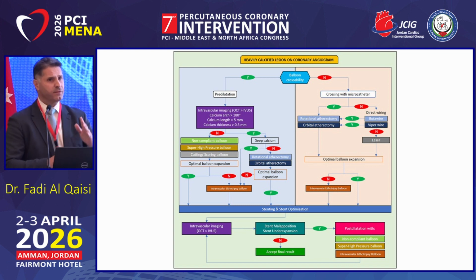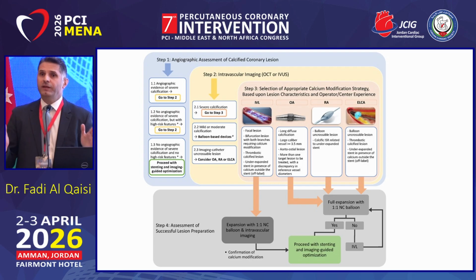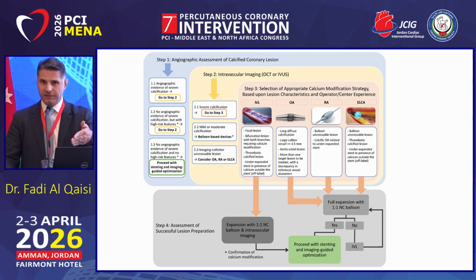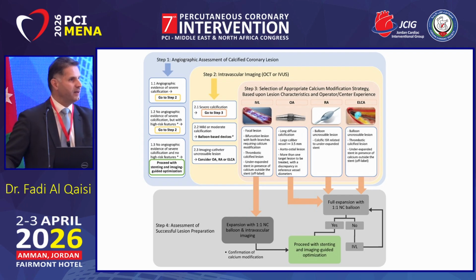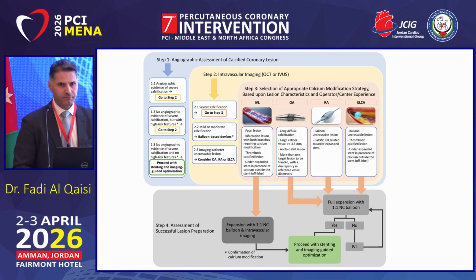Of course there is an algorithm. You can cross the lesion, you cannot cross the lesion, what to do, how to approach all of these things. I will skip this for the sake of time. And you can choose which one is going to be best. Obviously, this algorithm is very useful, but with experience and time, with the look of the lesion, you will do that algorithm in your brain and you will know which device you think is best for this patient.